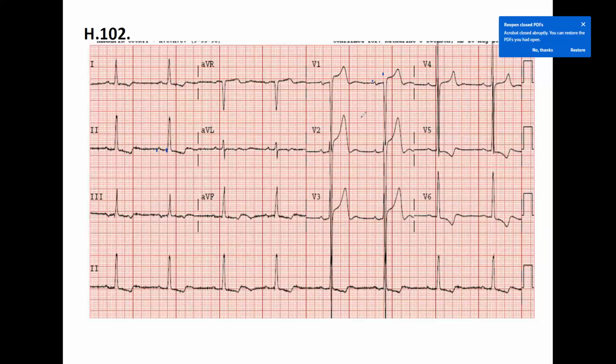If not every P is followed, but you do have a rhythmically produced P wave, but not every time is followed by QRS, that's the second degree. We are evaluating the AV blocks here. Or if it's short, the pre-excitation syndrome. Here we do have a little bit elongated PR interval, but every P followed by QRS. So that means we do have a first degree AV block. Okay, good.